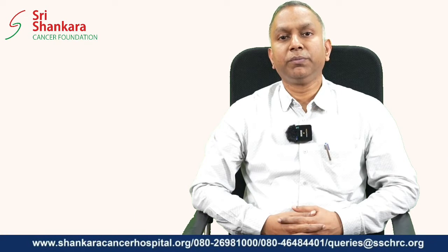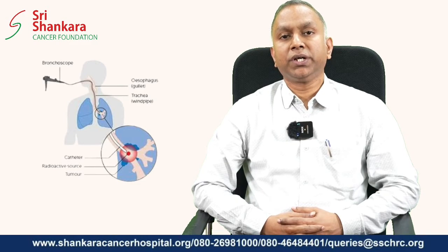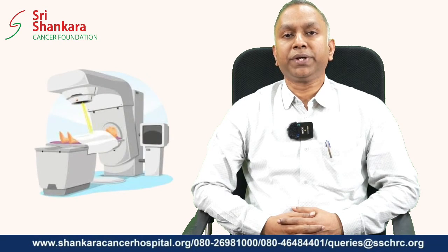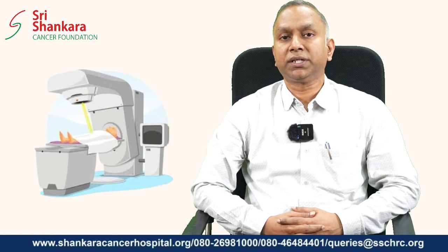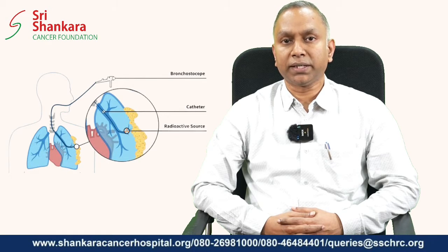Today we will be talking about brachytherapy. In general, there are different ways radiation can be delivered. There is external beam radiotherapy or teletherapy, where the radiation is delivered from a distance. The other form of delivering radiotherapy is called internal treatment or brachytherapy.